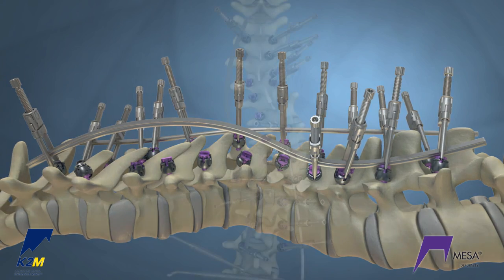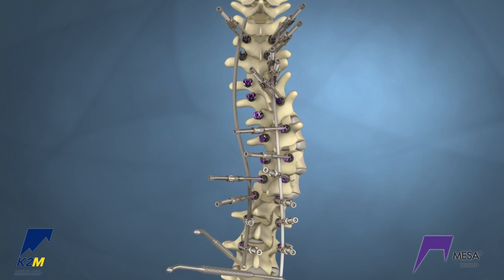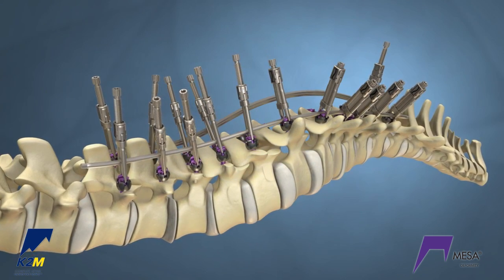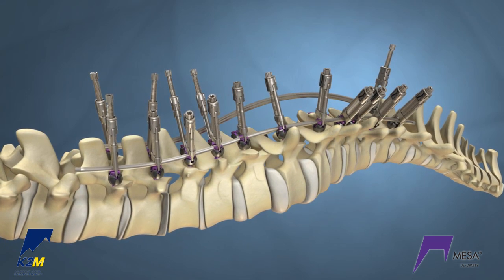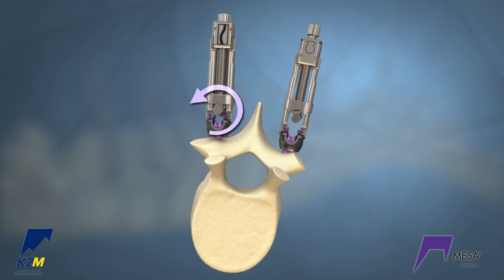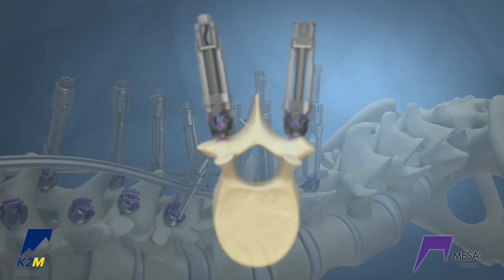Once the initial crickets are in place, rotate the rod and the rail into the proper sagittal alignment and hold in place. Slowly reduce the crickets on the convex side, working toward the distal end until the convex rod is sitting just above the inner collet of the screws. Fully reduce the bottom 2 crickets. Rotation will occur around the axis of this rod. Leaving the rod proud of the screw head provides freedom for rotation and reduces the potential friction.